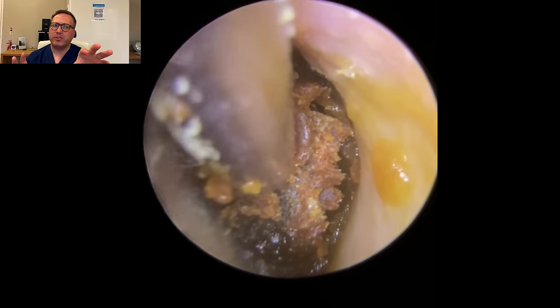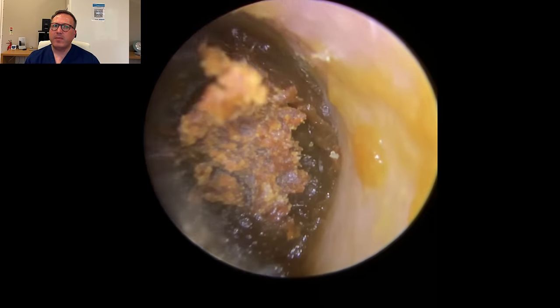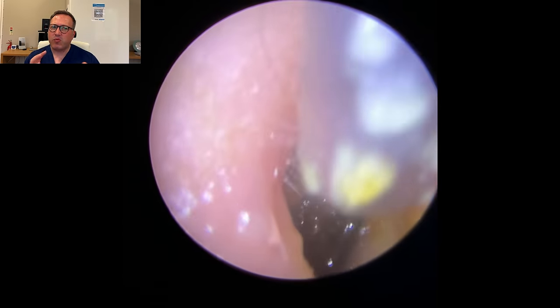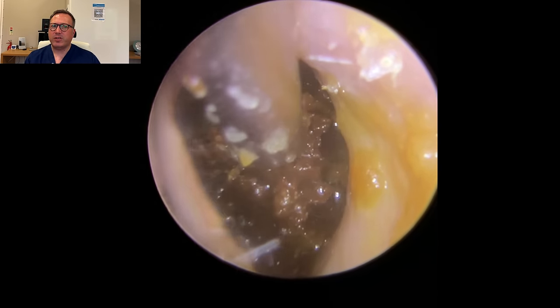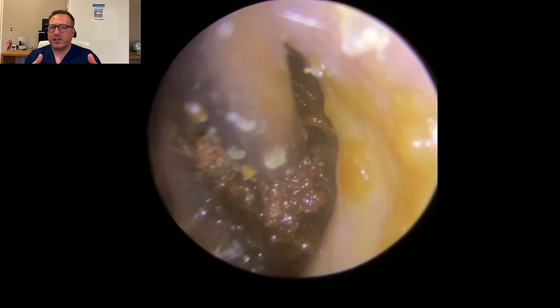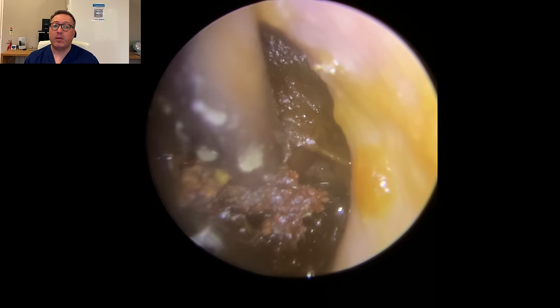You'll see here at the top how the wax is really stubborn, holding itself in really, really firmly. So if we just get a grip on that piece - look how that's moving back and forth, really just rocking back and forth. We're going to introduce a little bit of olive oil in here just to work it down the sides of this wax. Because if it is quite sticky and that's what's holding this in, the olive oil will form a barrier between the wax and the canal wall, which will allow it to slide across the skin and reduce the likelihood of it sticking against the canal wall again.